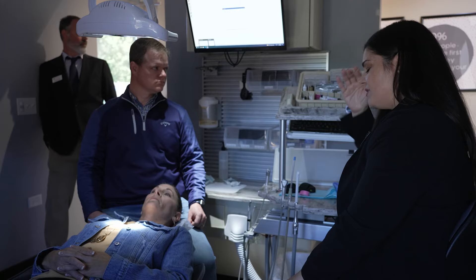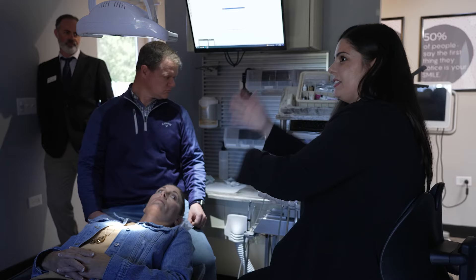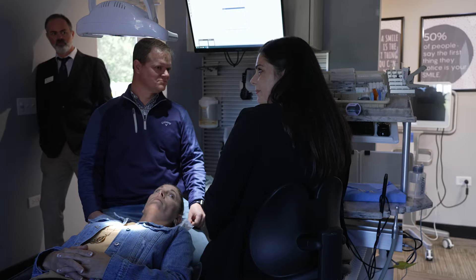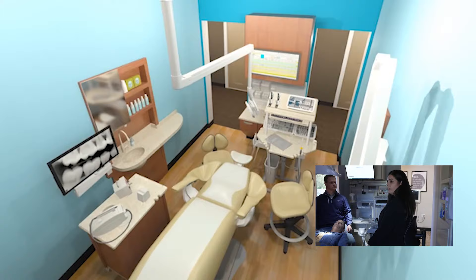This saved me many times. Dr. Hearn is my mentor, but he'll push you so you can become better. Once I got that aha moment — I'm close enough, I know what our standard is, I'm seeing. So he's calling off a jarred store. He just wanted to see if I'm on my game. I already had a cassette, handpiece, and fur block coming in. That's it — 80 to 90% of the time. That other 10 to 20%, we're bringing in our rapid cards. But if you need to pivot, you have it here.